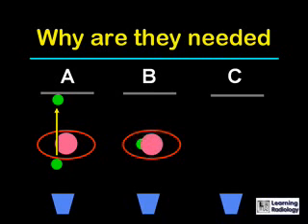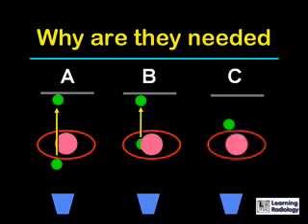Patient B has a lesion that's inside the chest. It projects in the same position on their X-ray film. And patient C has a lesion posteriorly in the skin on the back, and it projects in the same location. So clearly it would be difficult to tell from just one view where this lesion was located.